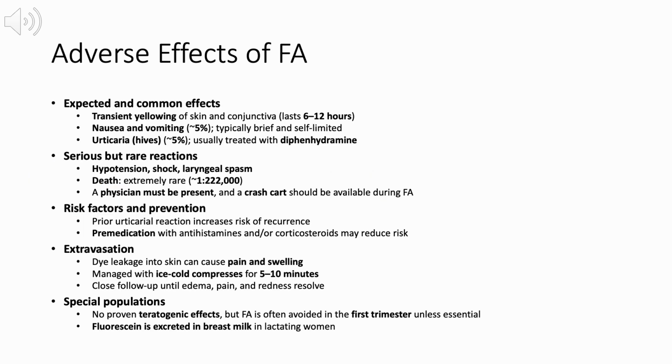Before concluding the discussion of fluorescein angiography, it is important to review its potential adverse effects. Most reactions are expected and common. These include transient yellowing of the skin and conjunctiva lasting 6 to 12 hours. Nausea and vomiting occur in approximately 5% of patients and are typically brief and self-limited. Urticaria, also occurring in about 5% of cases, is usually managed with diphenhydramine.